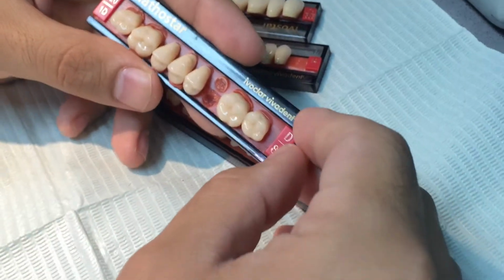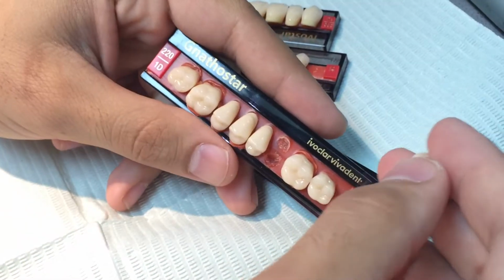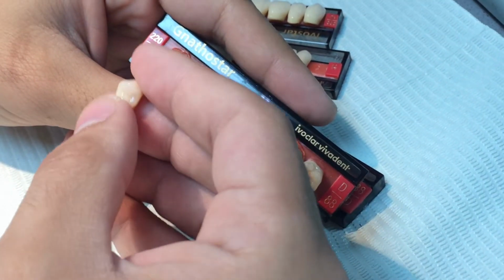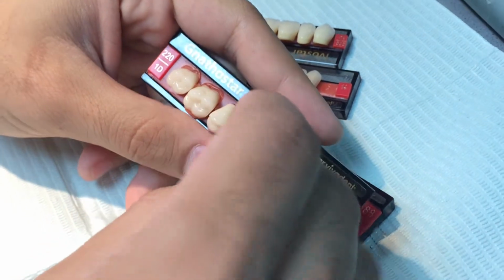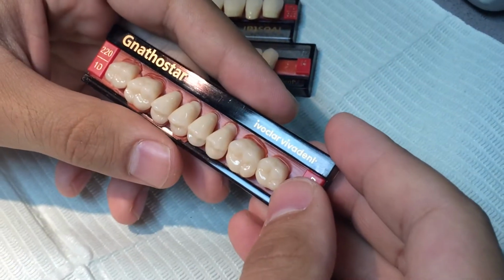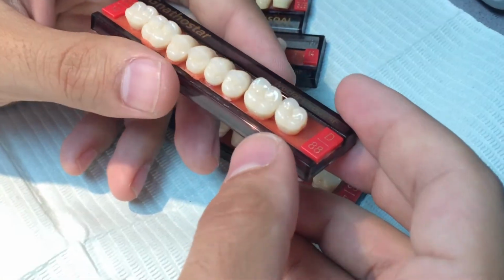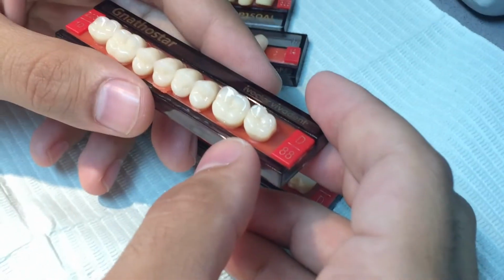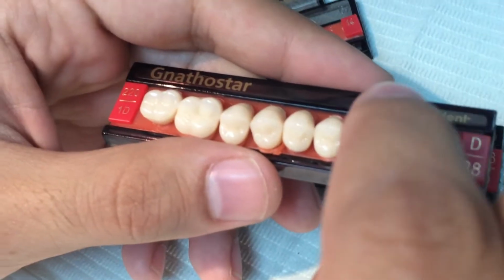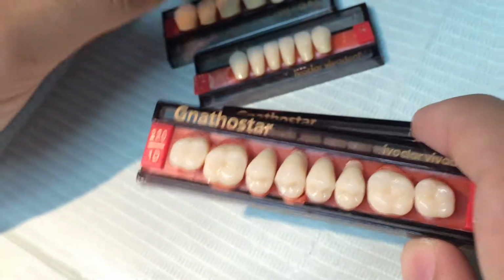Let's say if I take out one single tooth from here, I'm going to do setting for that tooth. If it's okay and I want to make it later, I have to take it back to its position so that it will not mix up. Like when you're working on setting for this tooth, let's say you're going to do it after a break or whatever, you would have to take the tooth back to its position so that you will not mix up all the teeth.